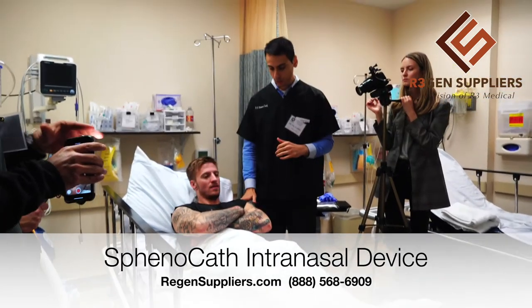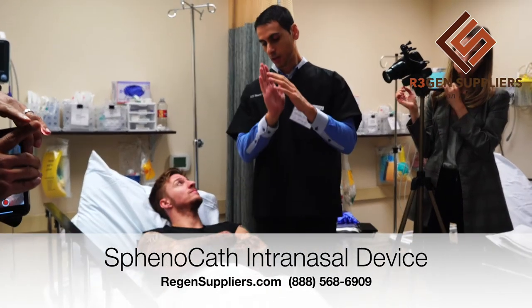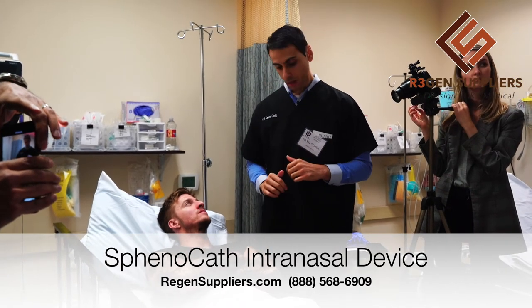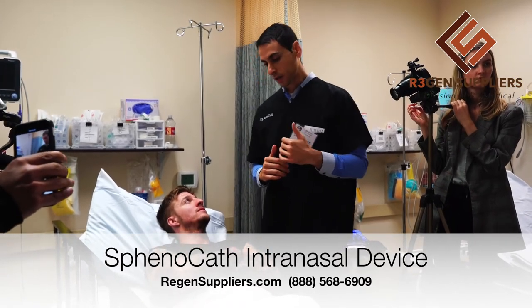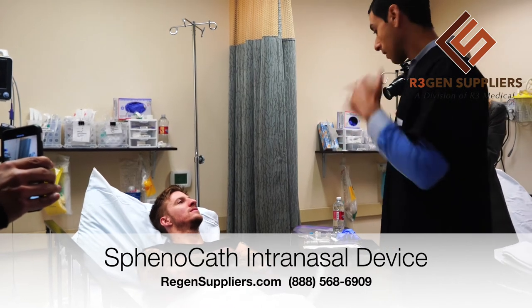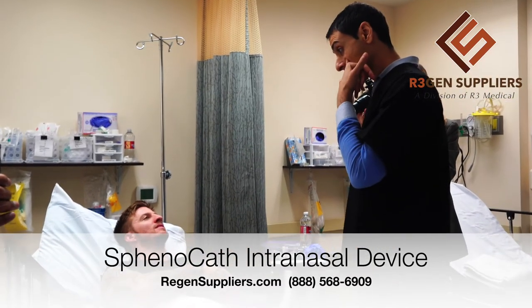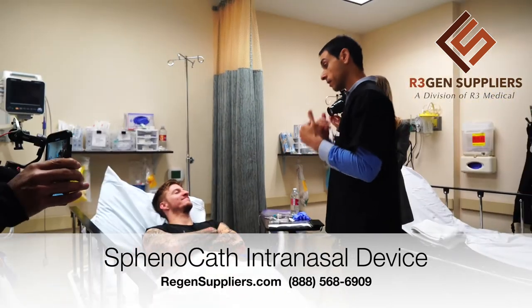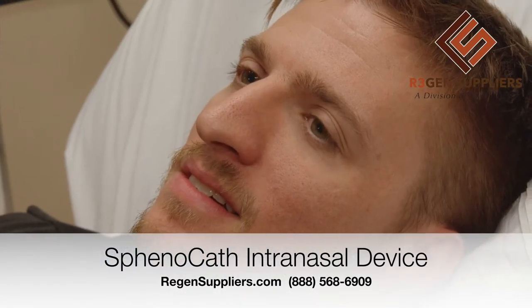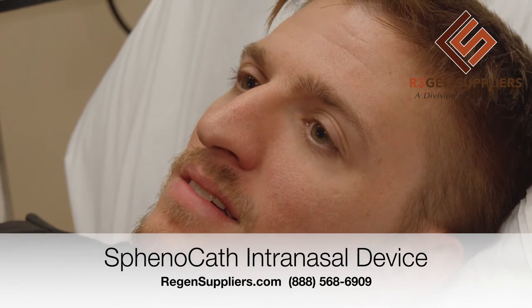What will happen is we're going to put you in a position where your head will be extended backwards, because what we want to make sure — and it might be a little bit uncomfortable — is that the sensation around the sphenopalatine nerve area doesn't cause you to lift your head up.